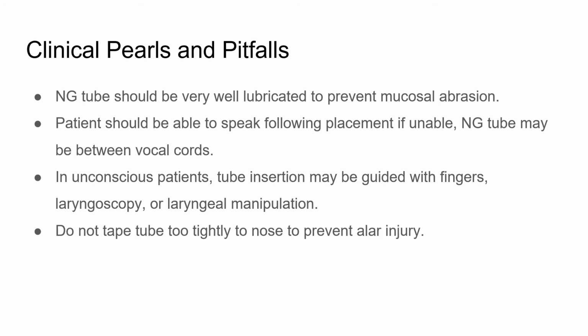Do not tape the tube too tightly to the nose, to prevent alar injury. It should not be too tight, or too loose so that it can come out. So it has to be adequately placed in position.